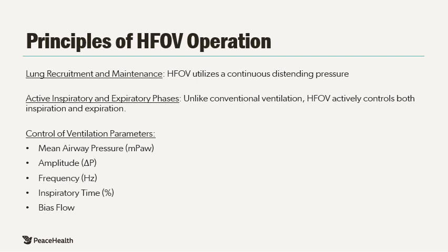Lower frequencies result in larger tidal volumes and enhance carbon dioxide clearance, while higher frequencies produce smaller volumes and can reduce carbon dioxide clearance. This is because our total cycle time will be affected by frequency. Lower frequencies will increase our total cycle time, allowing for longer exhalation periods.